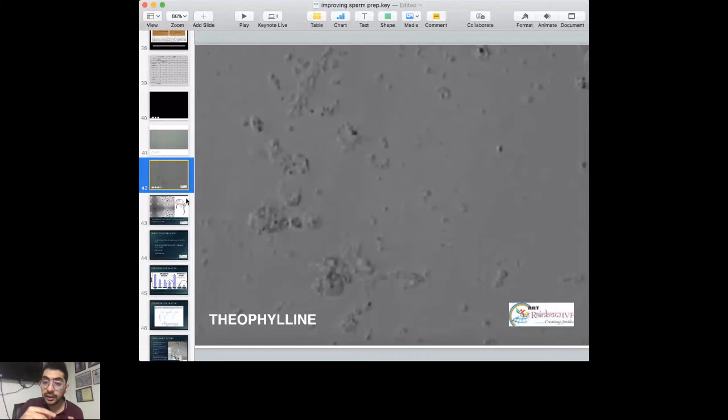And that is why, when you're using a HOS test, a normal sperm will be coiled, and an abnormal sperm will look like a normal sperm with a straight tail. So that's what you can do. I have a video for it. I'll show it to you once I'm done with the presentation.